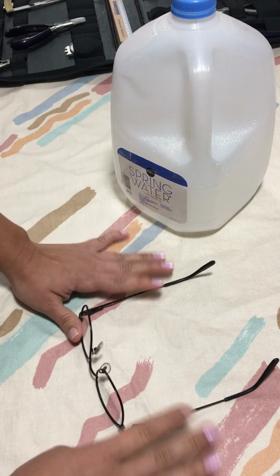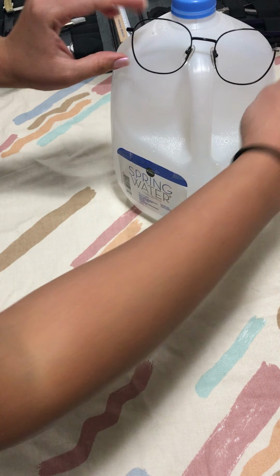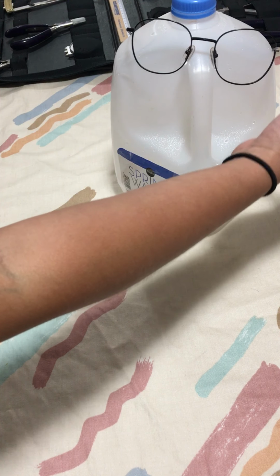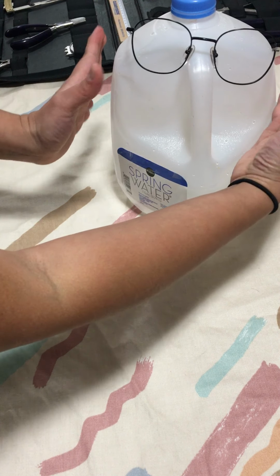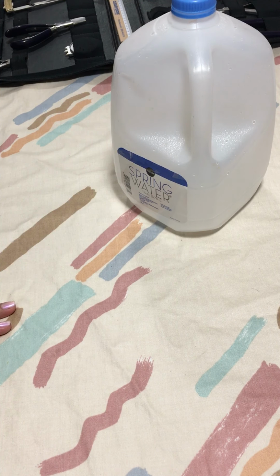It's a lot more even right now. And when I actually put it on the patient's face, now it's not as falling. We see a little bit of a difference because it's missing a screw, but it's a lot more straight than before when it had temple parallelism.